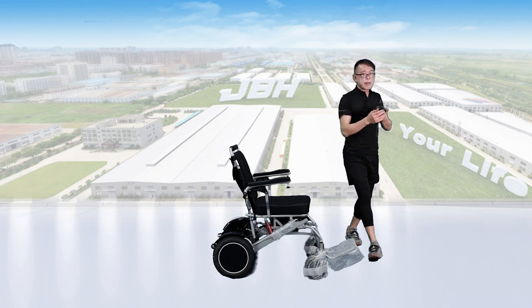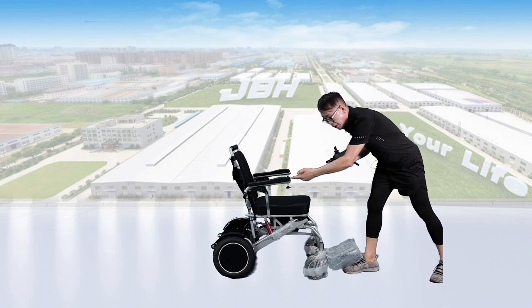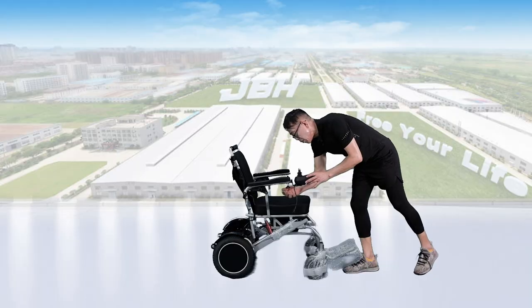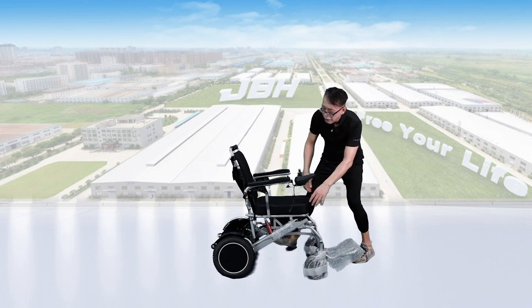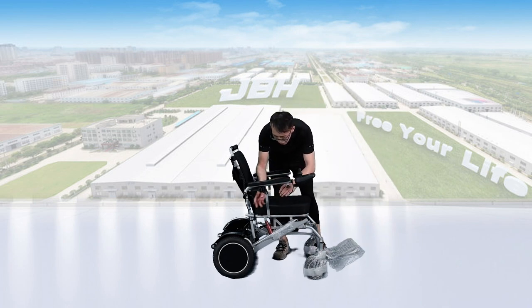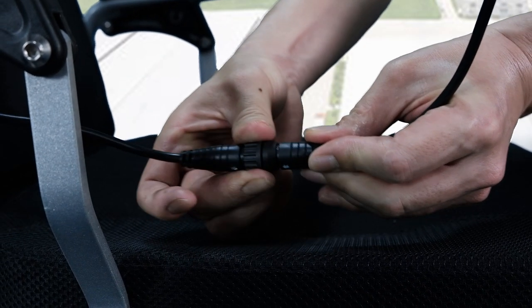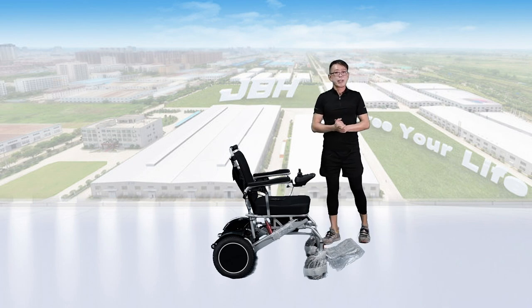The final thing is the controller. There is an insert pipe and a pipe under the armrest. Simply slide it in and then turn the knob to tighten. Then connect the connector — you'll find arrows on both connectors. Match them together, insert them, and turn the knob in the middle to tighten. The connection is now well set.